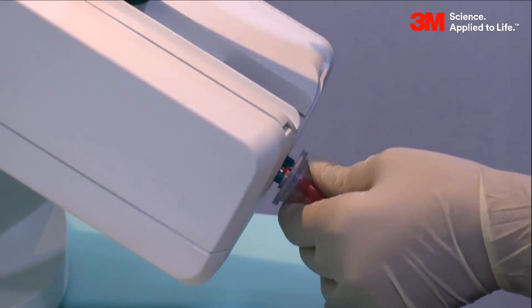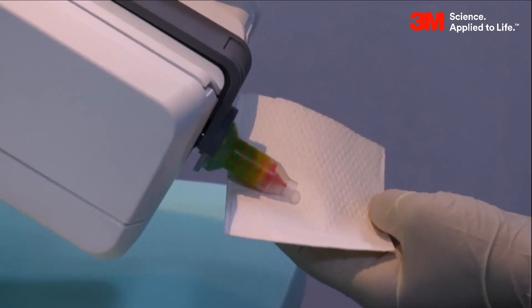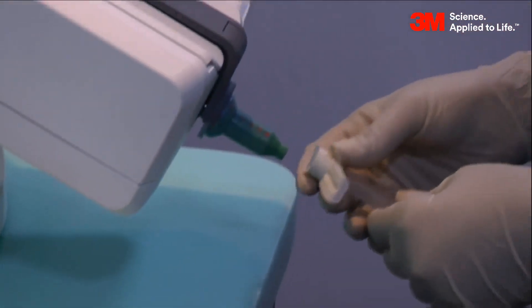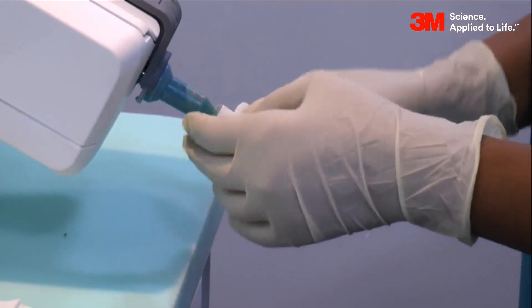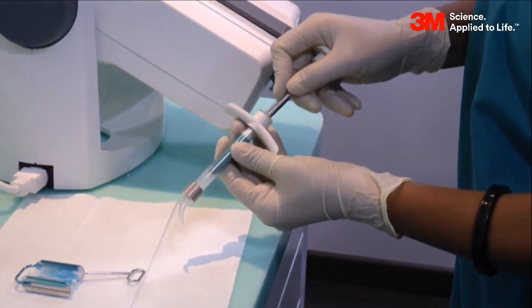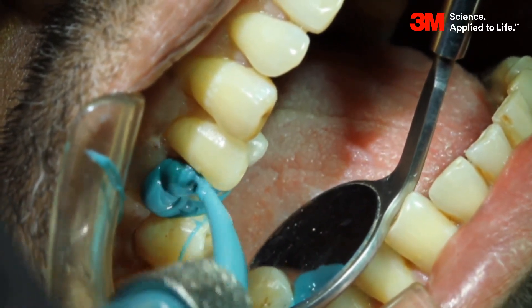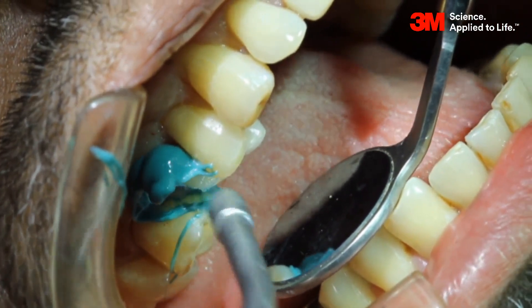Attach a penta mixing tip for the 3M SPA monophase poly ether impressioning material to flow. Dispense a small amount of poly ether impressioning material onto a tissue paper to check the setting time while recording the case on the patient. Take the 3M elastomeric syringe and load it with 3M SPA monophase poly ether impressioning material. We are using this with an elastomeric syringe filled completely with monophase.